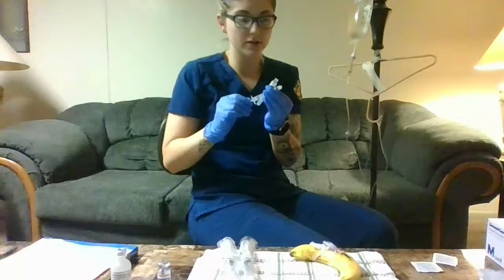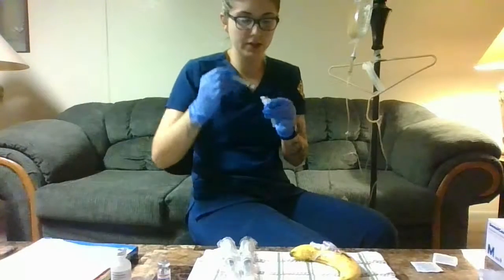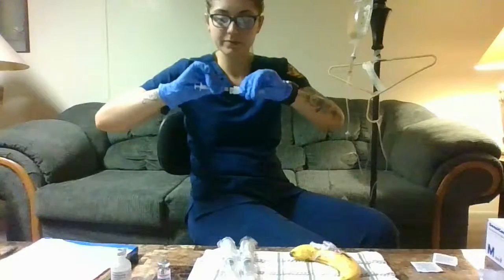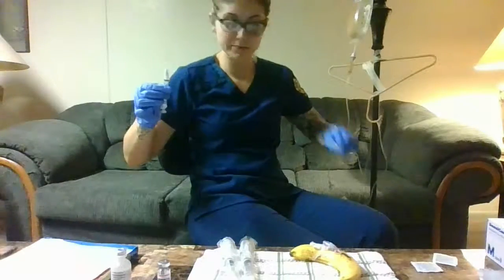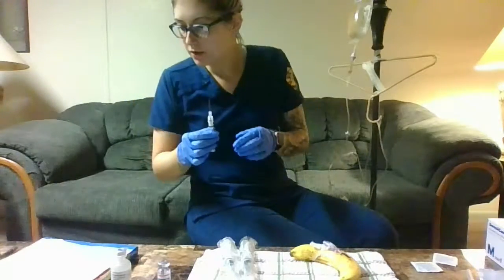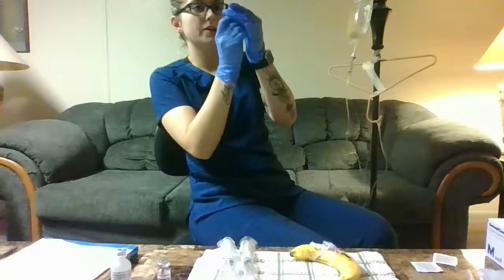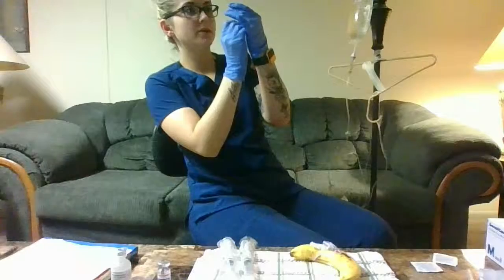So I'll make sure that's working there. Gonna click that in, open this up. Okay. So the first thing we need to draw up is the dilaudid, 1 milliliter. So we're gonna drop air, 1 milliliter.